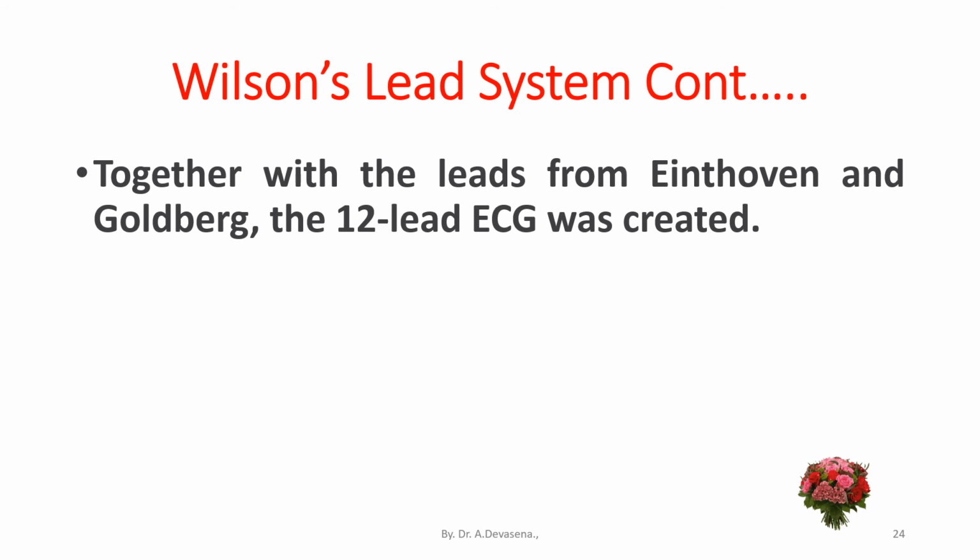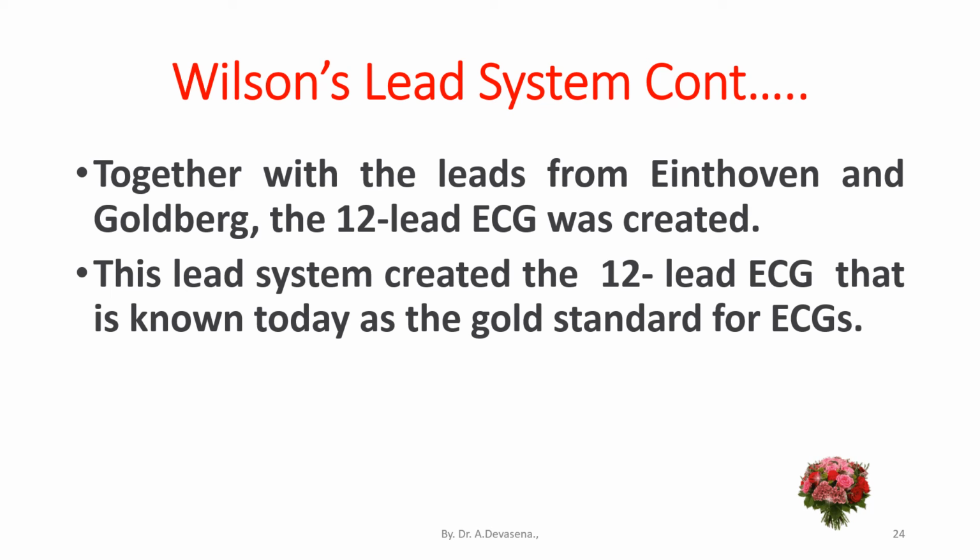Together with the leads from Einthoven and Goldberger, the 12-lead ECG was created. This lead system created the 12-lead ECG that is known today as the gold standard for ECGs.